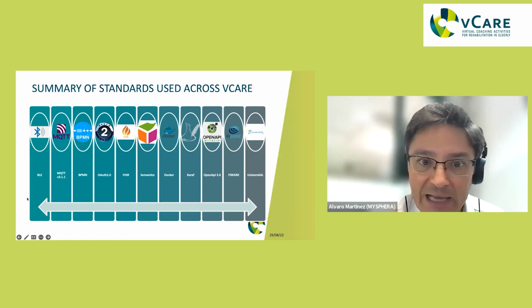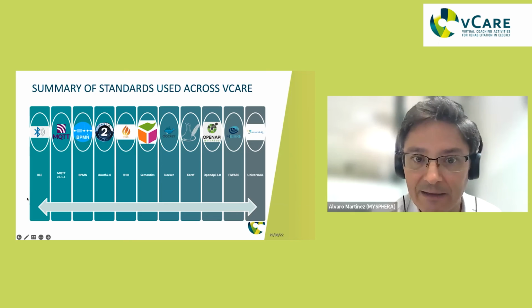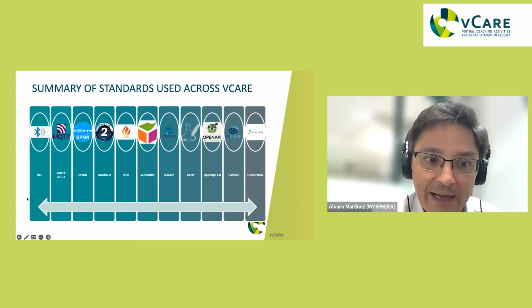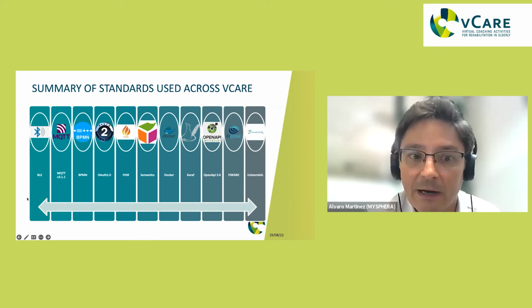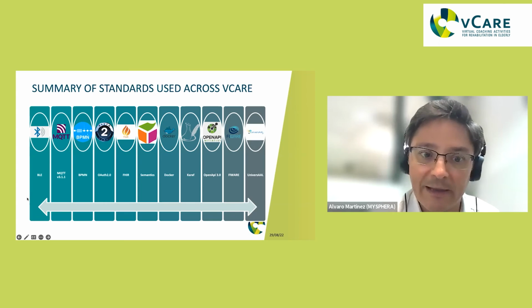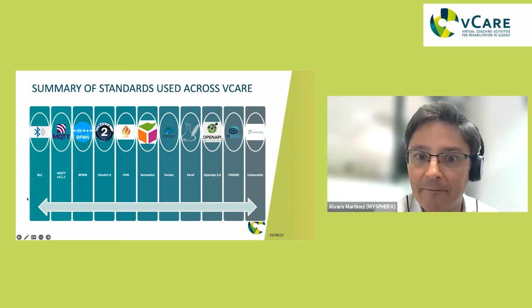From left to right, we can see Bluetooth Low Energy, which is the technology that we use mostly for medical devices and for devices that are at the point of care, the house of the patient, and more specifically by some specification called the GATT profiles, which is something internal to the protocol, and most of the providers already provide devices with this kind of formatting.